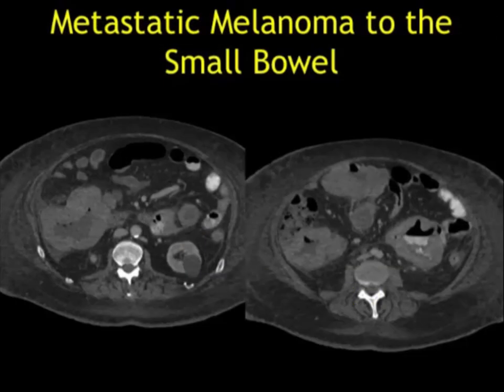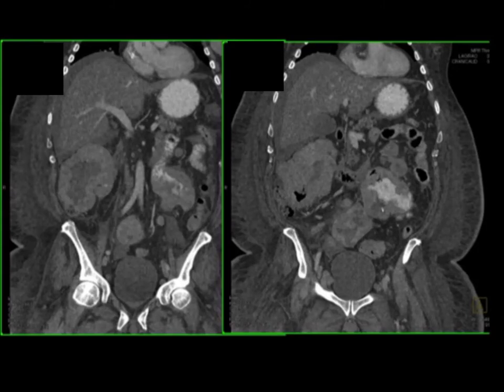I always think of melanoma when I see multiple, ulcerating, large lesions. Here's a mass involving the ascending as well as descending colon — classic metastatic melanoma to bowel. Tumors are often ulcerating. You've got to be thinking about small bowel evaluation. Sometimes patients are obstructed, which forces you to think about it, but other times patients present with routine follow-up or abdominal pain. You want to look carefully at the bowel. IV contrast is critical in making the right diagnosis as well as detecting a lesion.